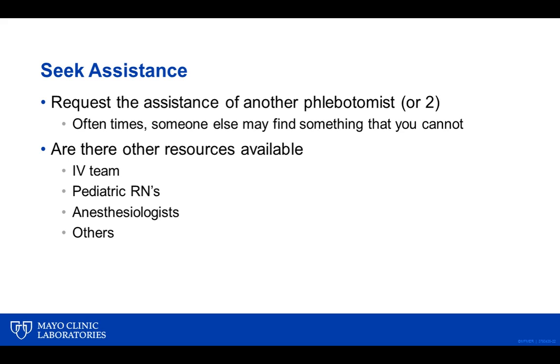Or in other words, by allowing this or even suggesting the patient do this, we have caused hemoconcentration. That, in turn, is going to result in us drawing more red blood cells in a given volume, which in turn will increase potassium. It will increase many, if not most, of our electrolytes, our chemistries. We also have to worry a bit about hemolysis because now we're trying to pull way more red blood cells through the lumen of that needle than would normally have been found in that vein because of that fist pumping.